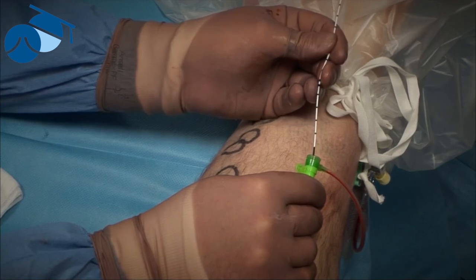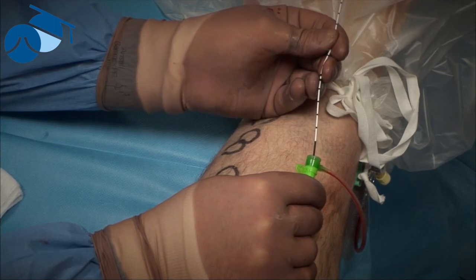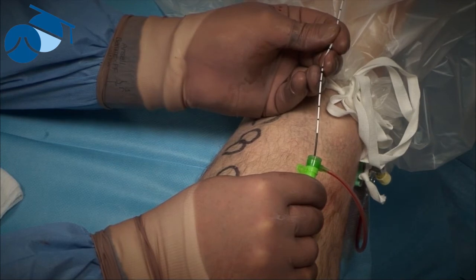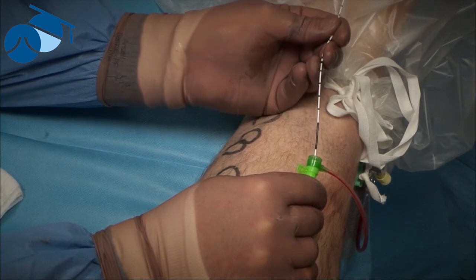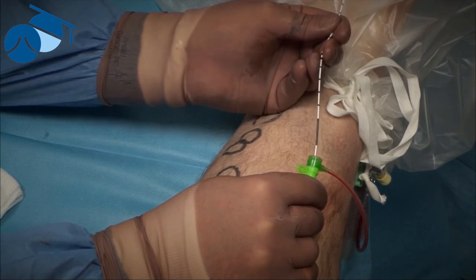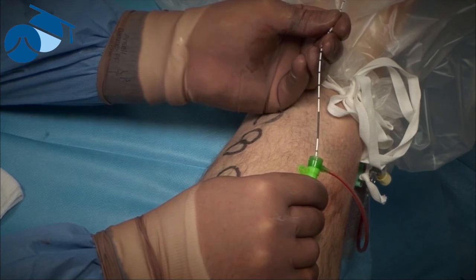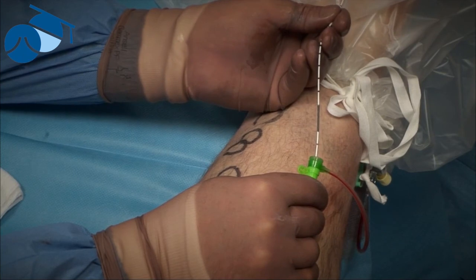And here we can see on this system now, we've got the first centimetre of all black marking, and there's going to be a second centimetre showing me that I've only got 2 centimetres left at the end. So 2 more centimetres, and then the end of the fibre is going to be as close as I want it to the catheter. I'll show you that as we pull out. And about 1 centimetre there, and we're coming to the second centimetre, and at that point we're stopping.